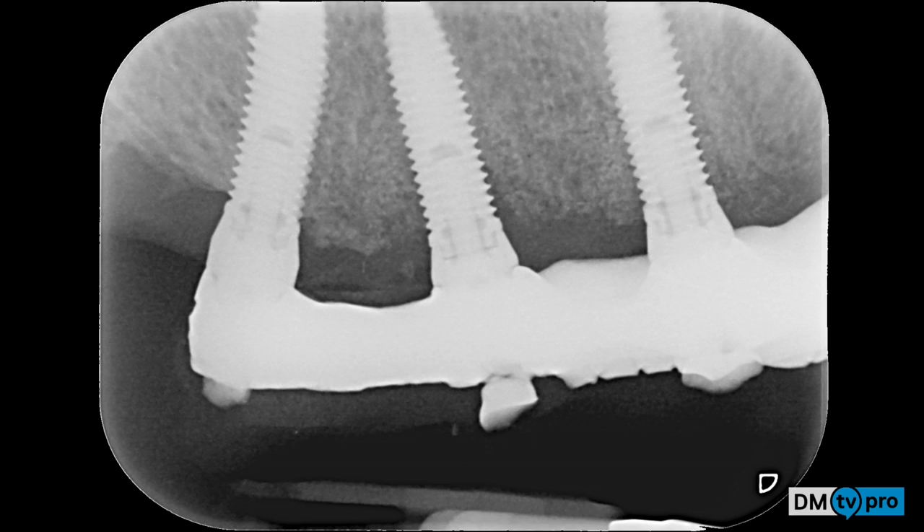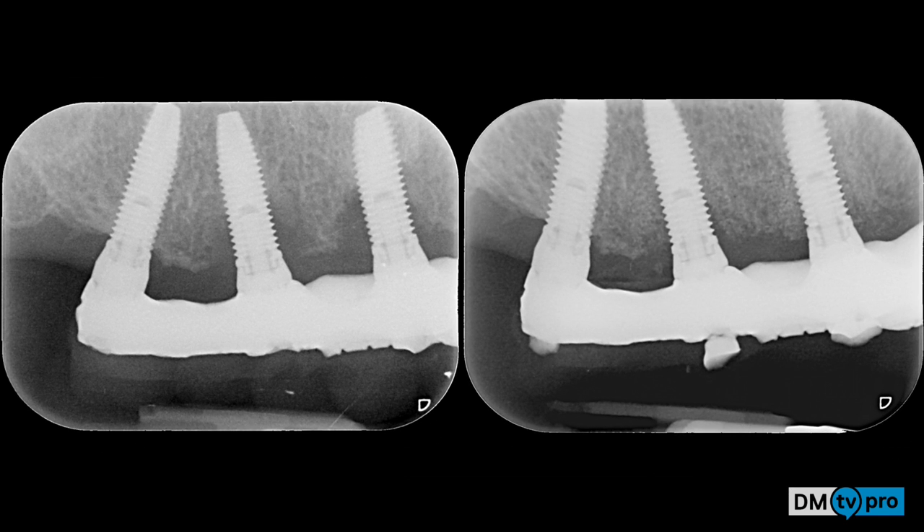At a six-month x-ray, a nice bone filling around the two implants that had peri-implantitis is shown.